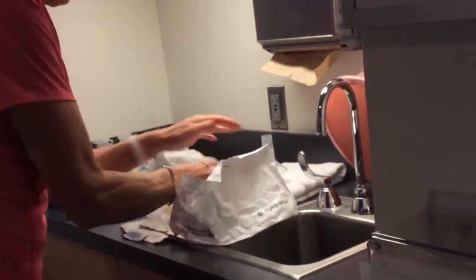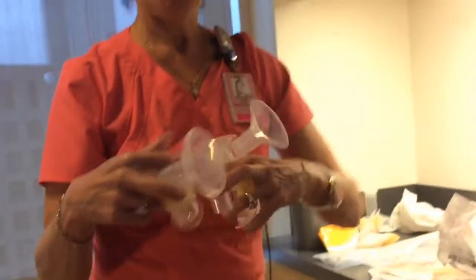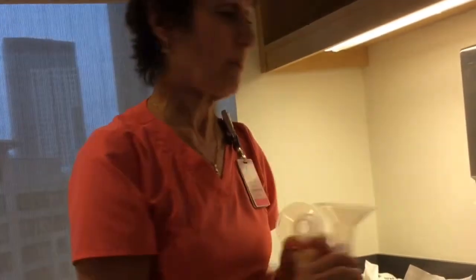The kit comes with two size breast shields: number 24 — each shield has the number written on it — and number 27. And as everyone knows in the NICU, we have larger number 30 shields in our supply.